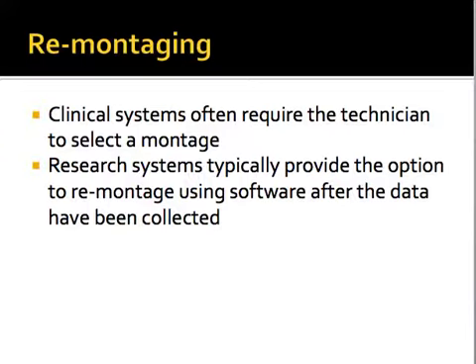Research systems, on the other hand, usually provide the option to remontage after the fact using software, because the data are not recorded as montage data. They're recorded as just channel data, just the way the data come in, and then the actual referencing is done after the fact, because these systems also have a ground or a virtual ground.